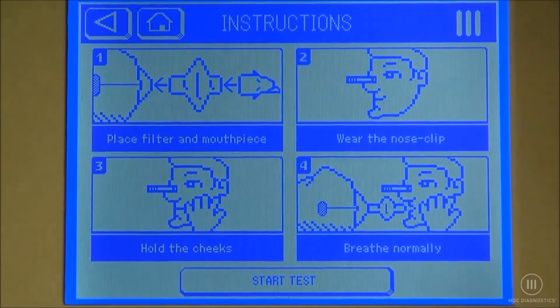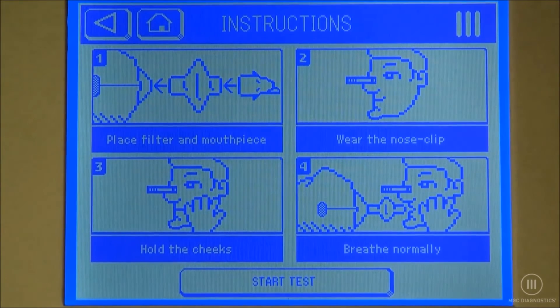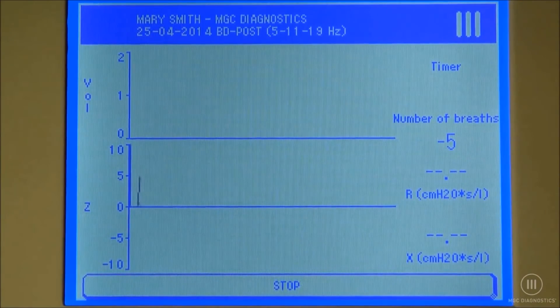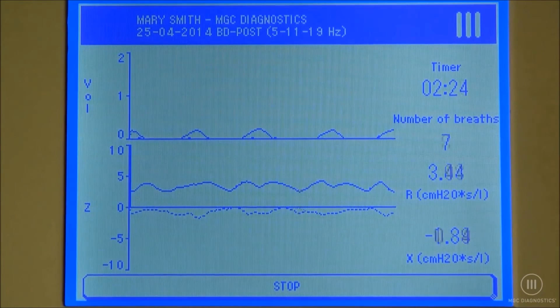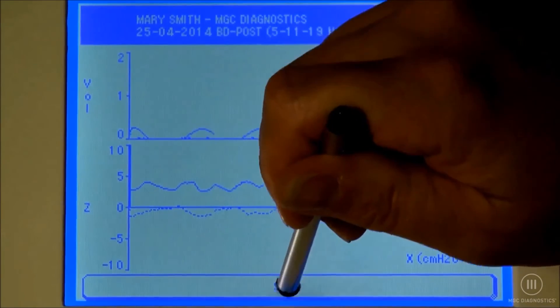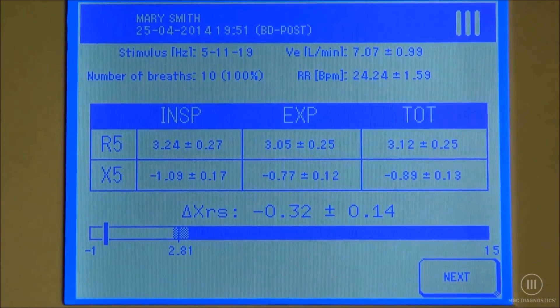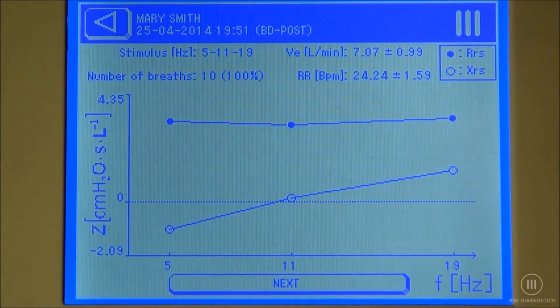We're going to have our patient attached to the FOT device, nose clip on, hands on her cheeks, breathing normally. We're going to select start test.